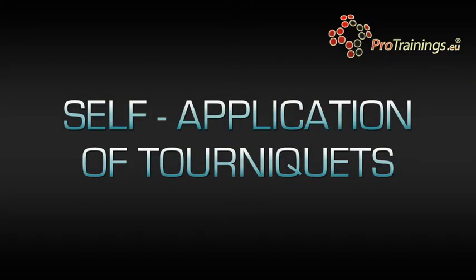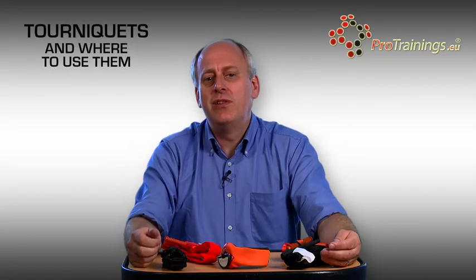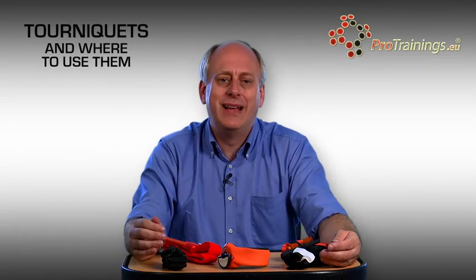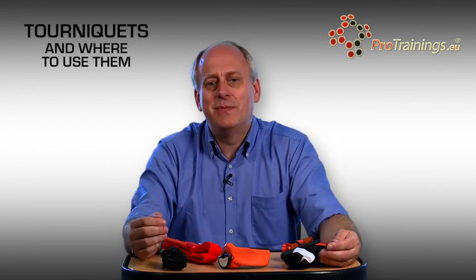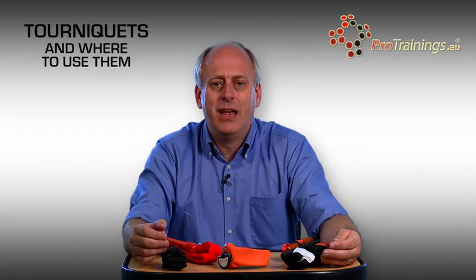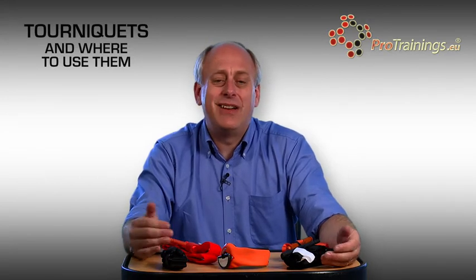Tourniquets can be applied to yourself one-handed if you need to, and this has been done very effectively in military settings across the world. Tourniquets are only removed in a hospital by a doctor and never by the first aider, even if the patient complains about the pain of the tourniquet. This pain should reduce as the area goes numb.